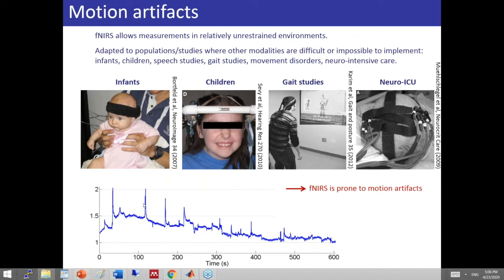So how do these occur? Majority of the time, this is due to the optode scalp decoupling. Each source or detector, we call an optode, it's crucial to keep scalp optode contacts for the proper light piping. If an optode moves and quickly comes back to its original location, generally this ends up creating a spike in the data as we see here. If the optode ends up on a different location on the scalp, this would mean a permanent change in the signal intensity, and so will appear as a baseline shift in the signal. We have a baseline shift here, like the signal was going like this, and then there is this baseline shift and also a spike, but then the signal did not come back to its original level. So this is an example of that.